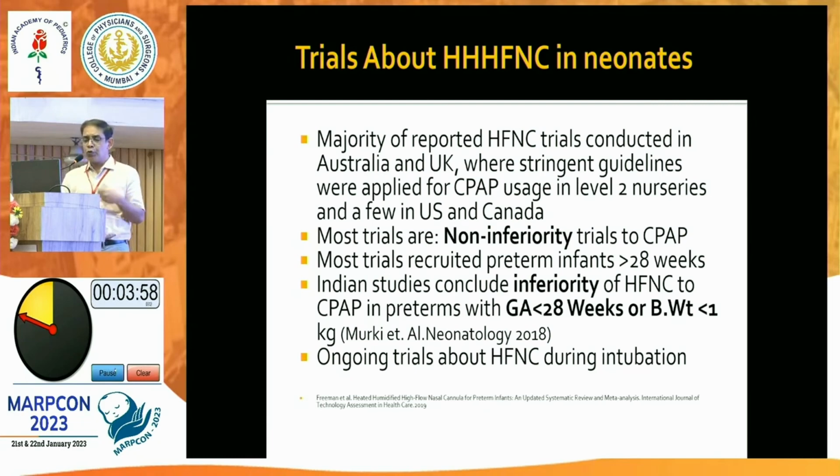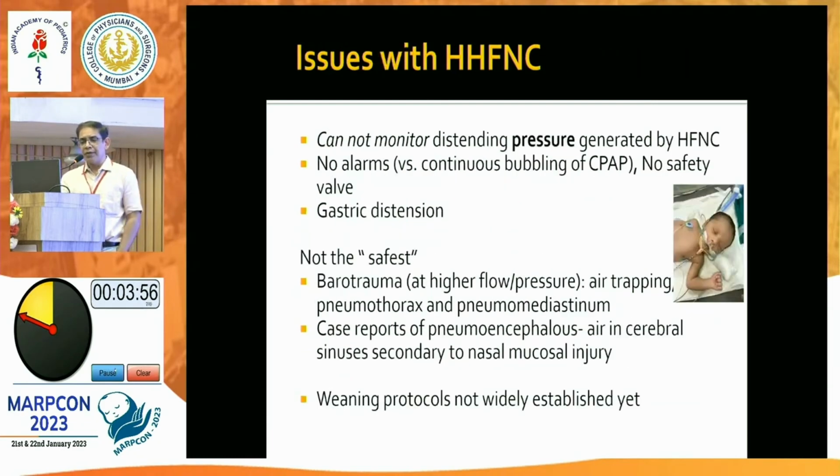So we will come to know what the results of these trials are. Now, HFNC also comes with its own issues. We cannot monitor how much pressure HFNC is giving, so that's why we don't keep on increasing the flow rate. We don't know what happens when we increase the flow rate beyond 8 or 9 liters or so.